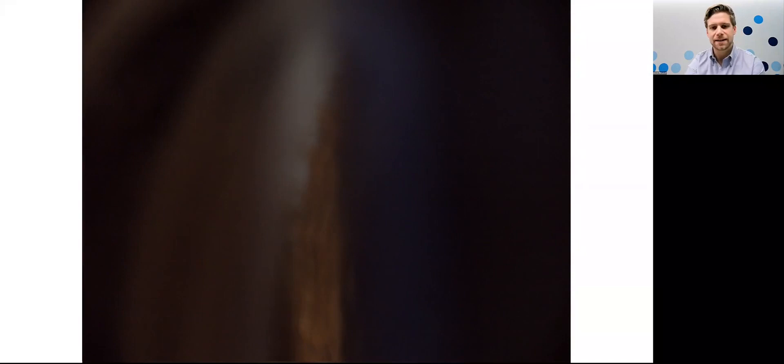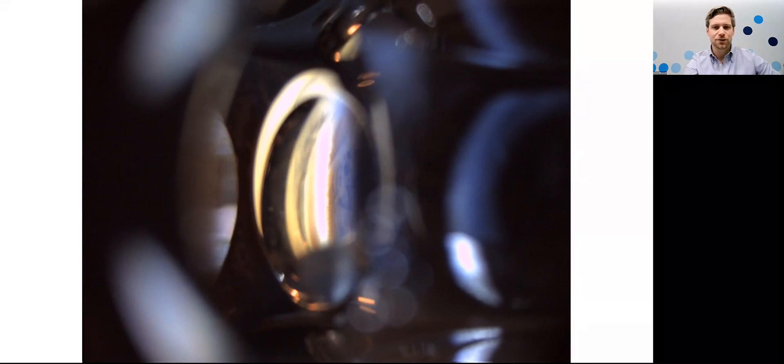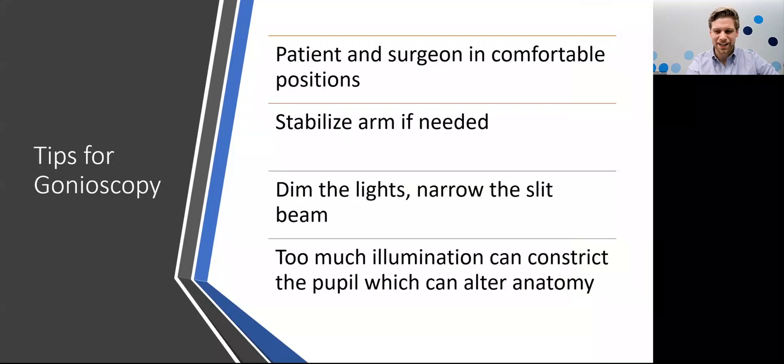Here's a video of what gonioscopy may look like — one of my technicians kindly volunteered. The light distortion is a lot higher because capturing this is more challenging than what you would see with your own eyes. This is a much broader slit beam than I would recommend. I really recommend a narrow slit beam to minimize pupillary constriction when evaluating the angle. One of these lenses is the Volk High Mag and the other is the G4 — this is slightly higher magnification. You can see some iris processes and a nice view of the angle. Looking through the microscope yourself, that will look very clear compared to what you're seeing on video.